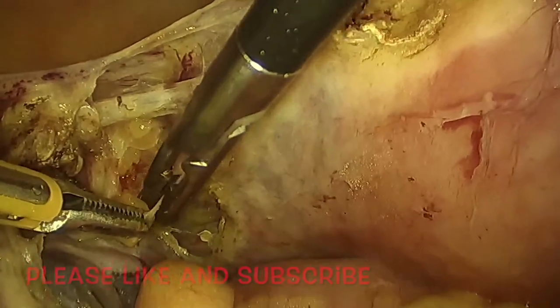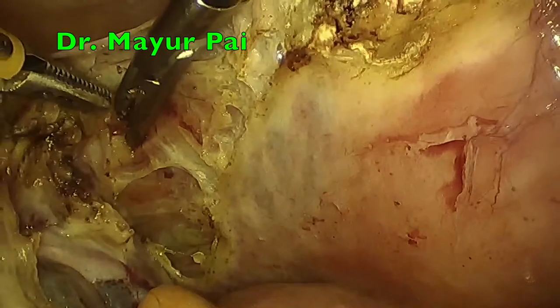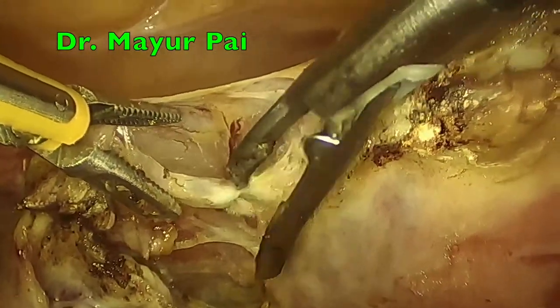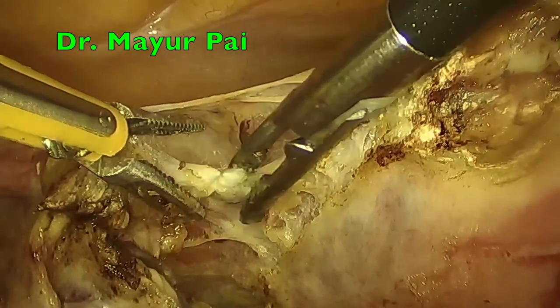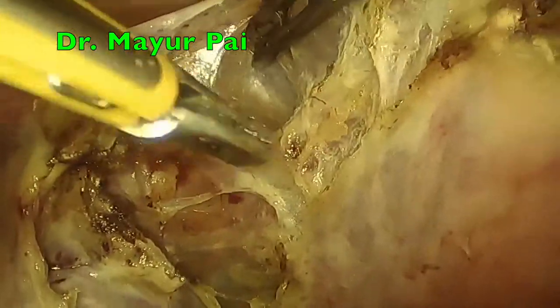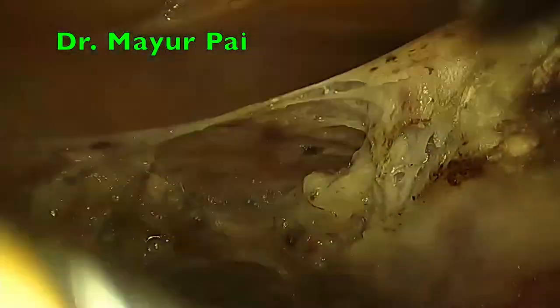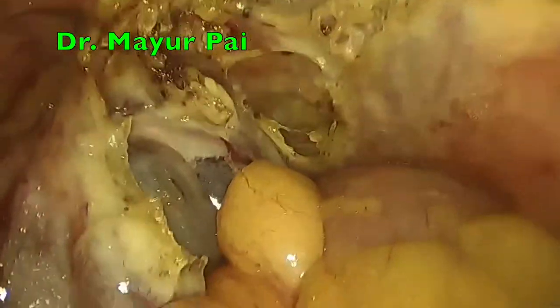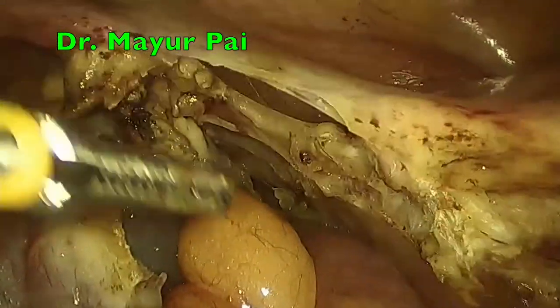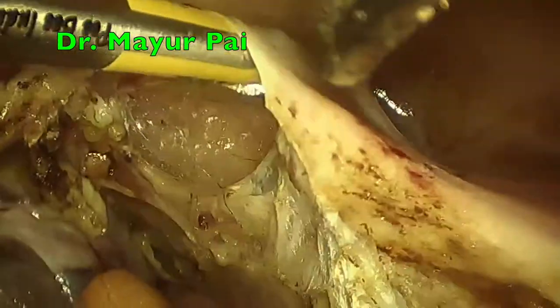To the surgeon, it gives us the opportunity to view the structures under magnification and to have very precise dissection of the different tissues. On the screen you can see that the posterior leaf of the broad ligament has been dissected out, and now we are proceeding anteriorly. The dissection and the cutting of the posterior leaf of peritoneum helps the ureter to be lateralized on its own naturally.